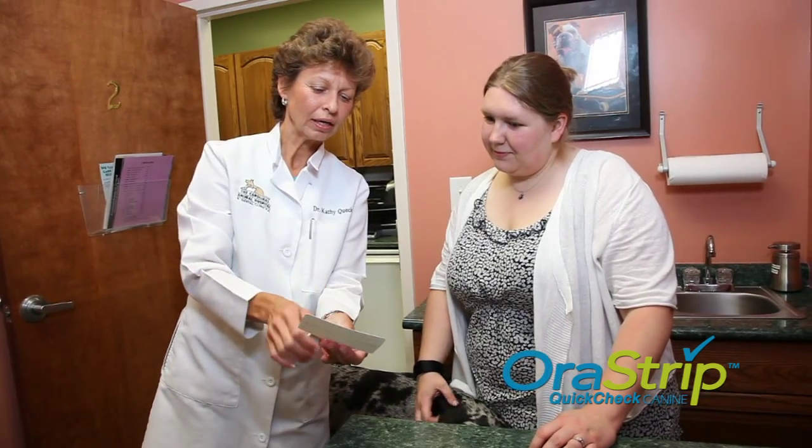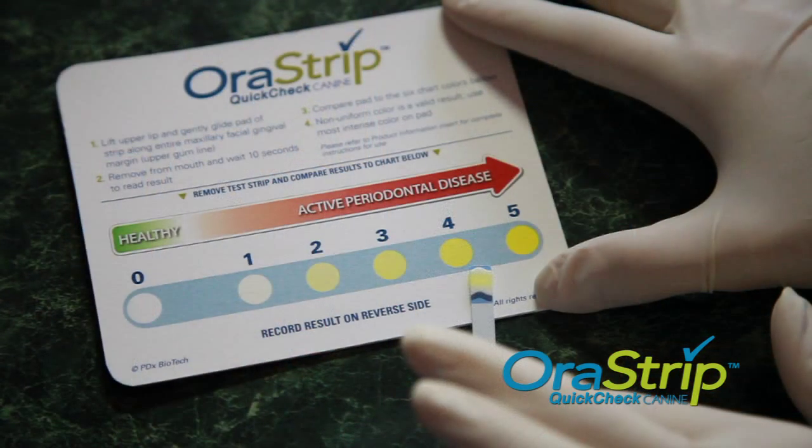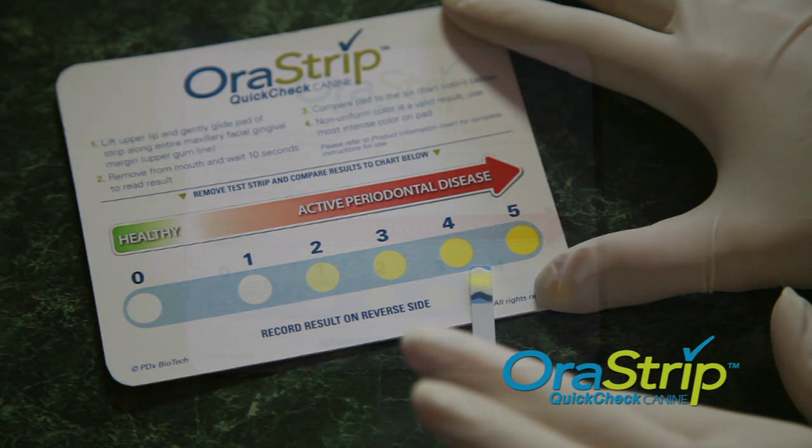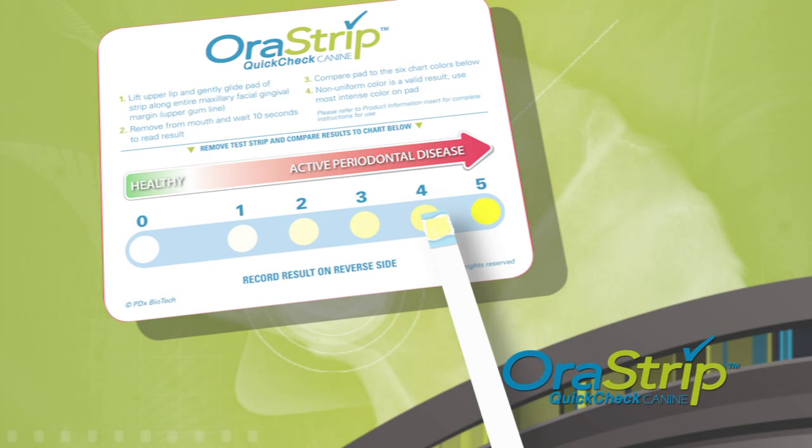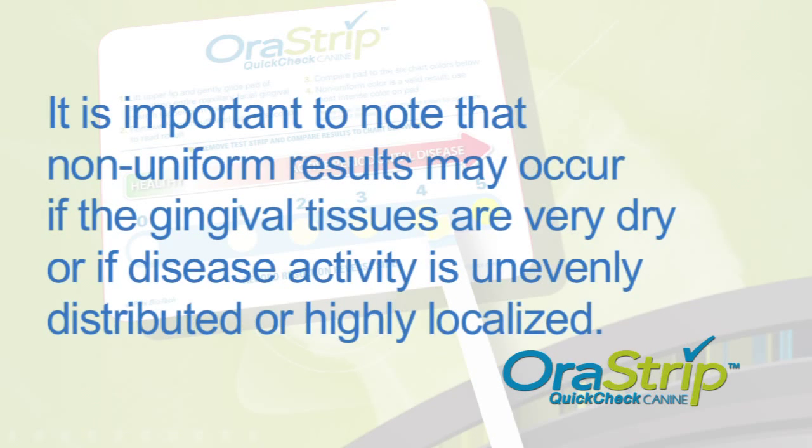To read the results, make sure you're in a well-lit area. Hold the OraStrip Quick Check test strip near the colors shown on the color comparator card provided. Determine and record the number on the chart that's nearest the closest matching color. If the color on the pad is not uniform, base your decision on the most intense color seen on the pad. It's important to note that non-uniform results may occur if the gingival tissues are very dry or if disease activity is unevenly distributed or highly localized.